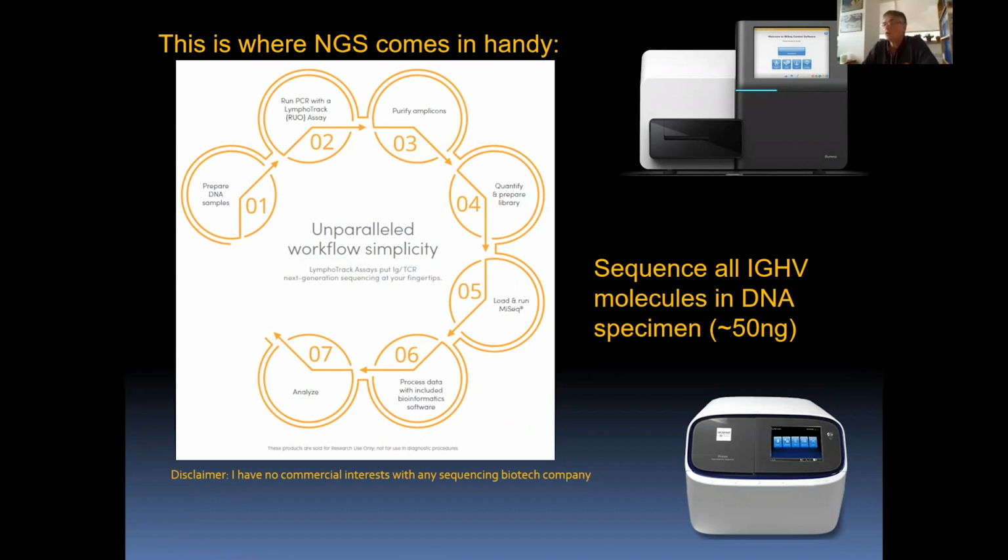The only way that you can make sense out of such a biclonal rearrangement is to actually go back to your gel with a razor blade, slice and separate both fragments, both bands, and elute the DNA from both bands, and then sequence each one individually. This is time consuming, but it can be done if you don't have access to next-gen sequencing.